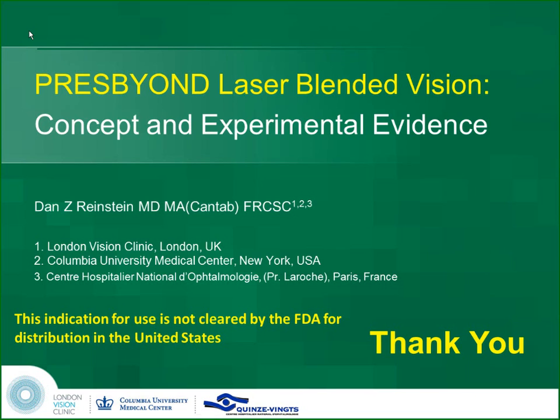If someone comes in, as was pointed out earlier in the panel, with very high, as Ala is worried about, if you do a high correction, you could be transferring someone into the dark zone for spherical aberration. Not good. But likewise, as someone mentioned, if you had someone who comes in with high spherical aberration, you could even do a low correction and drive them over the threshold. So the point of this software is to make sure that none of these eyes end up above threshold. That's the point.